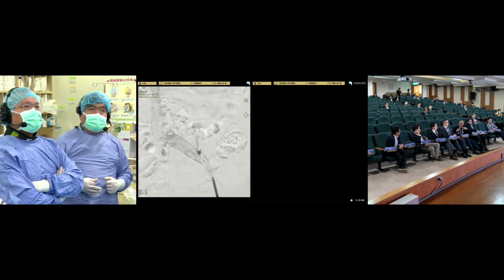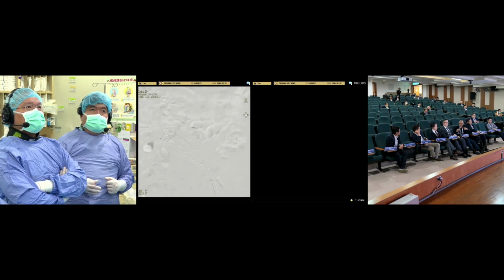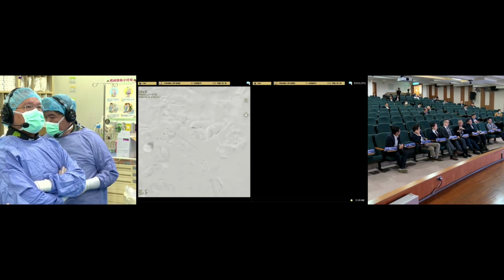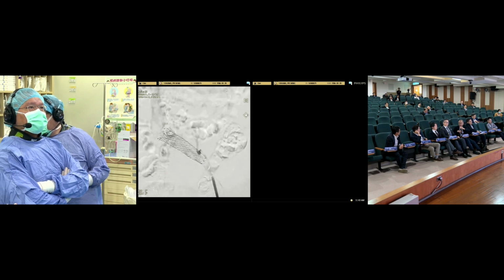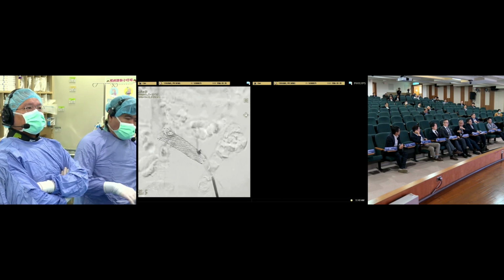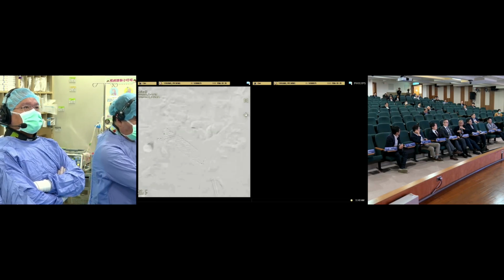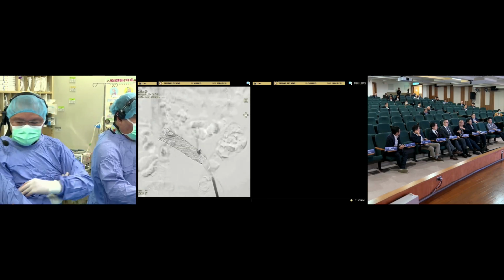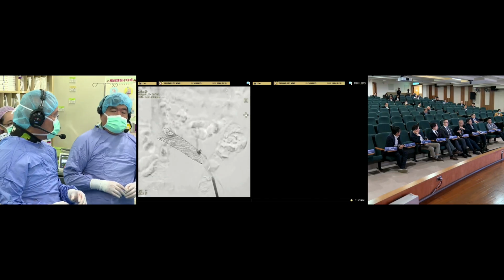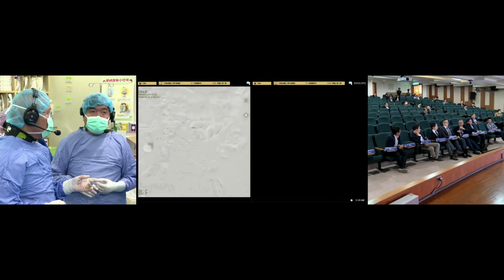For PTS, for compression syndromes, if after 6 months everything looks good on the duplex, I do duplex because my sonographer can do that, I would just convert them to a single antiplatelet agent. And I think that's due. If you look at the 3-year and 5-year data from Venova, we have 3- and 5-year data from using the Venova device. There are very few occlusions.